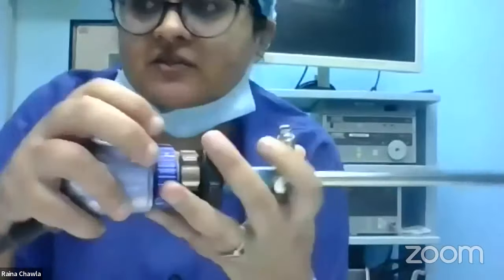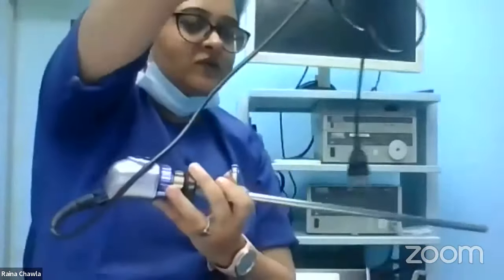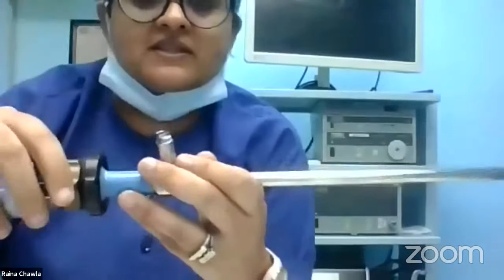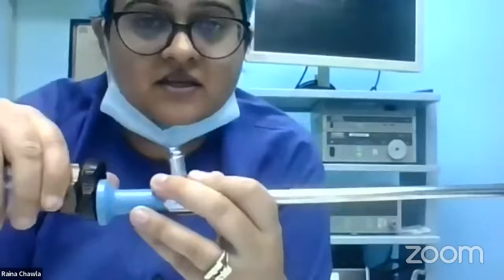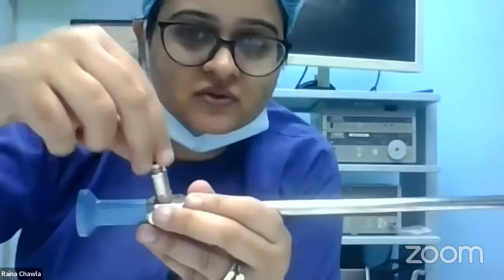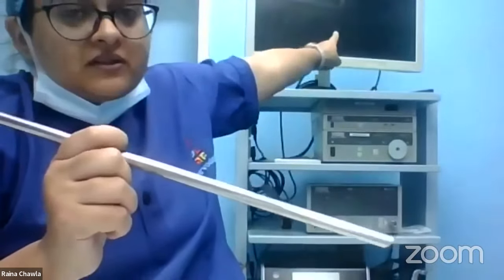Okay, you have different adjustments here. And this wire will go and connect to the camera system there. Okay, so this is a laparoscope. This is the camera which is attached here. Okay, and this is how we visualize. What comes here? Here comes the light source. The light will come here. The camera will come here. And we'll be able to visualize the image on the screen.